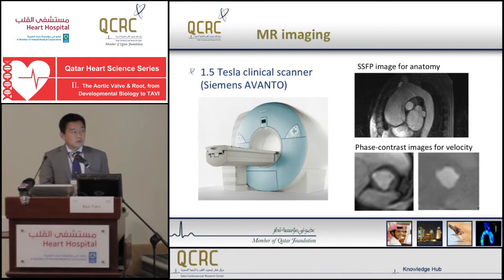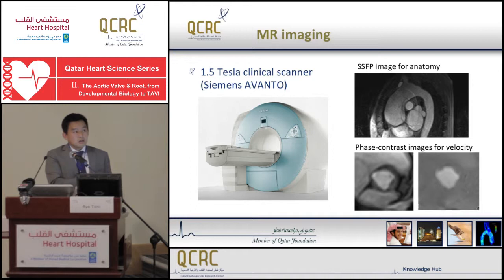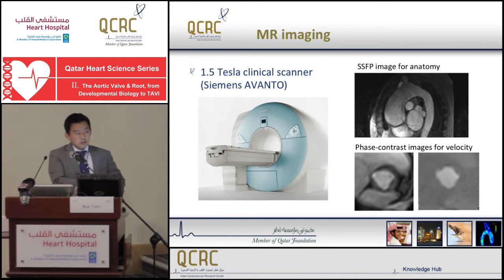For example, this is the Siemens Avanto, which is used in one of our collaborating hospitals. These are examples of acquired images — one showing the anatomy of the aorta from the aortic root to the thoracic descending aorta. The bottom ones are cross-sections of the aortic root, showing the velocity distributions of the flow.